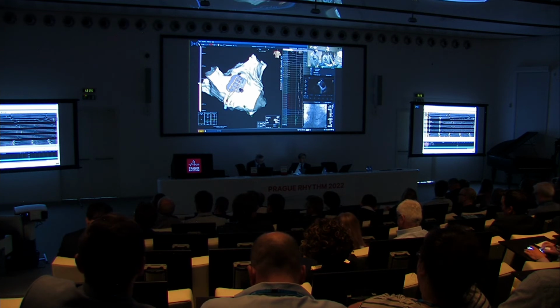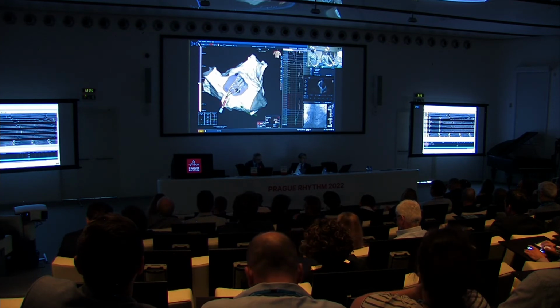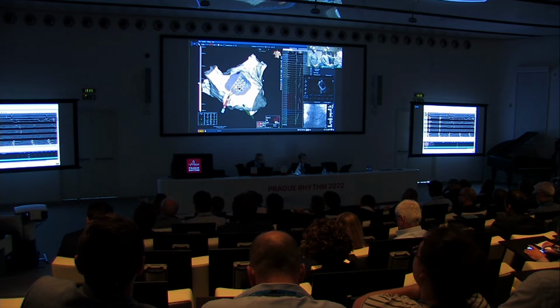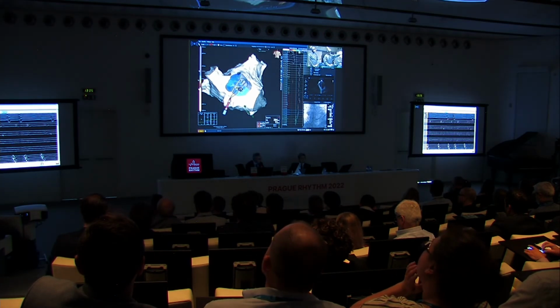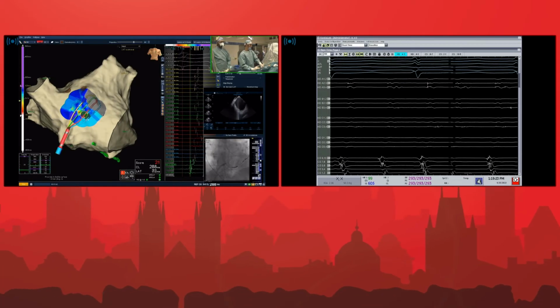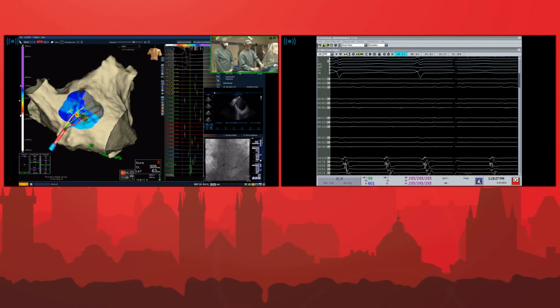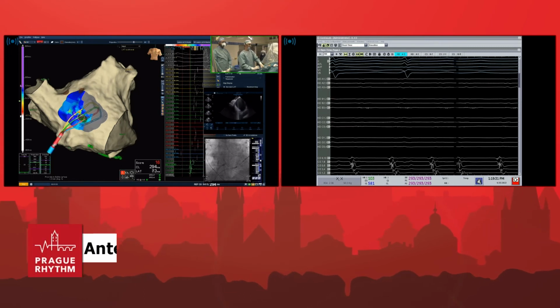On the ridge. Yeah. Right on the ridge. Should we put... Wow. Look at this. Look, guys. Look at the electrograms. First, I don't know if this is due to 2-to-1 block here, but look at B34. B34 is another side, so it's a perimitral flutter, obviously, but... Ooh, look at this. Look at the activity on B34.